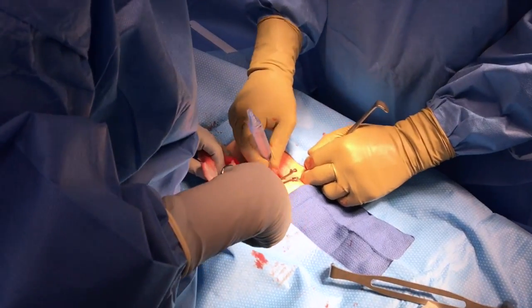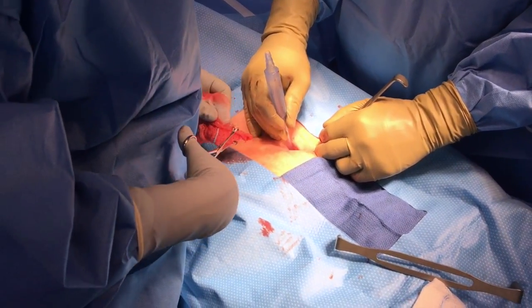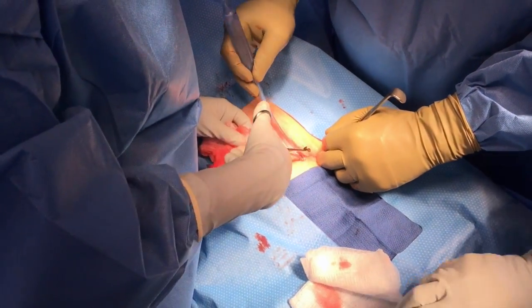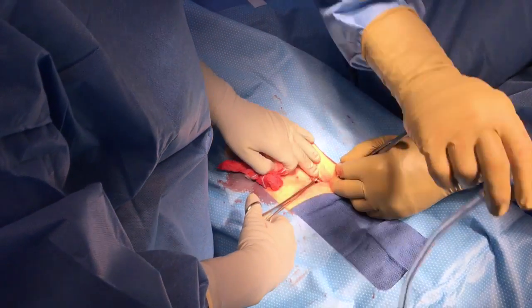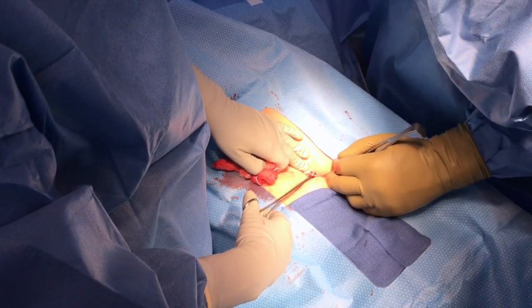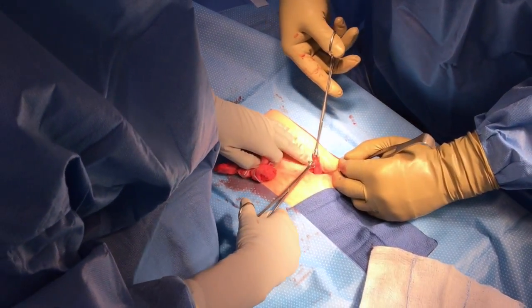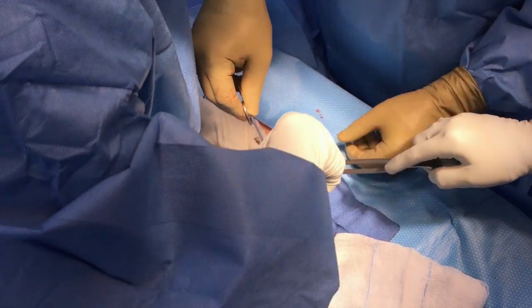Here you see the tube demonstrated well. Let's look at this from a different angle and look at the other tube being brought up. The surgeon should hold the retractor because the retractor hand and the hand holding the suction irrigator need to work in concert. The tip of the suction irrigator just slid behind the fundus with good pressure around to the side and elevated the tube upwards. It's usually pretty simple.